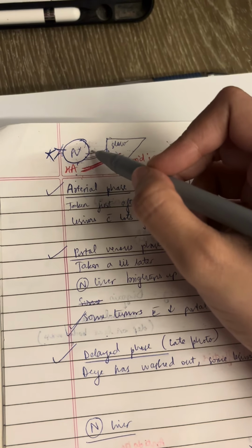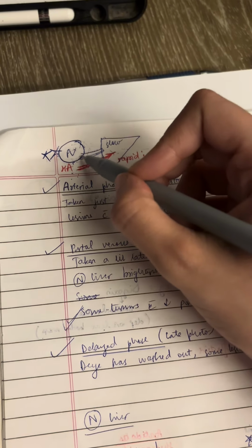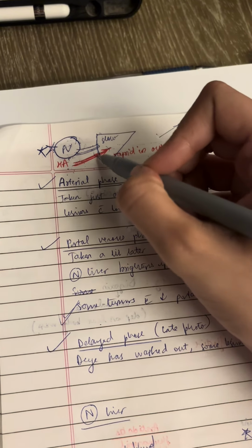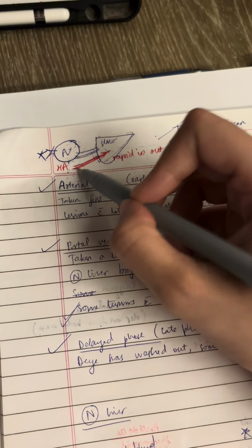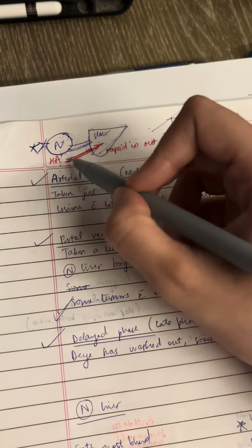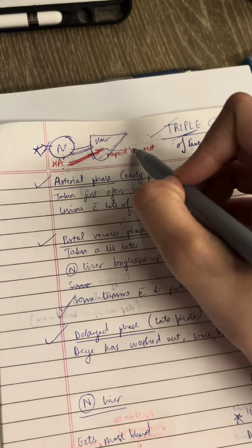Most of the blood that the liver gets is from the portal vein, and the nature of the blood flow is slow, gradual, and it entirely fills up the liver. But the blood that comes from the hepatic artery, since it's an artery, the flow of the blood is rapid. So the blood comes in rapidly, it goes out rapidly.